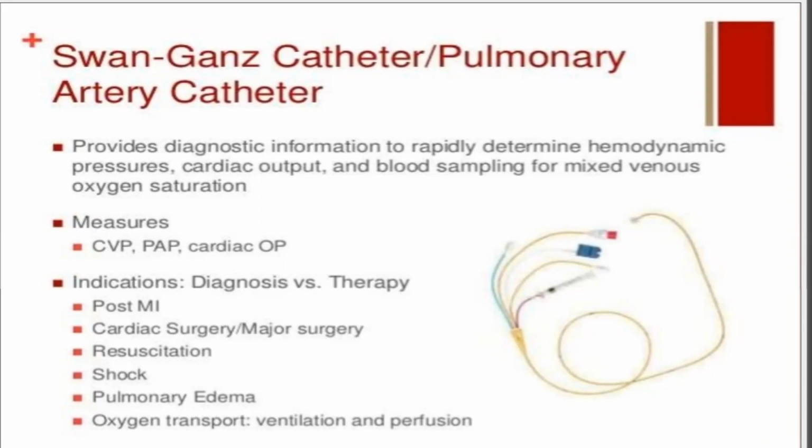Indications include some diagnostic and therapeutic terms like post-MI patients, cardiac surgery, or patients undergoing a major elective or emergency surgery, resuscitation, patients in shock, patients with pulmonary edema, and those who require oxygen transport, ventilation, and perfusion assessment.